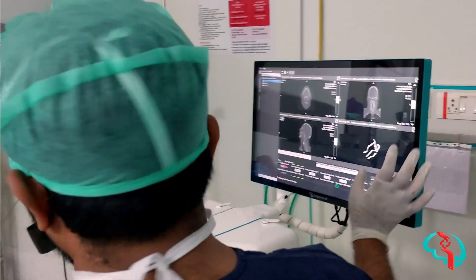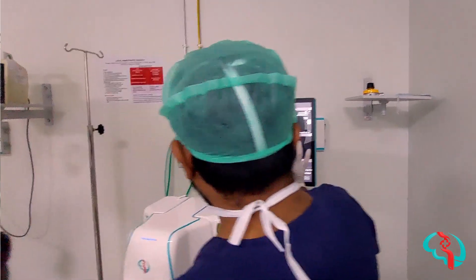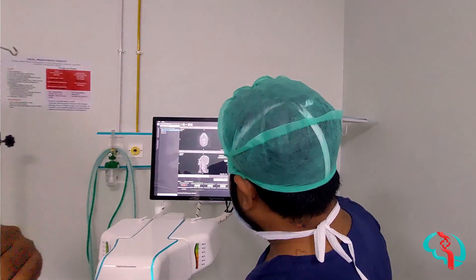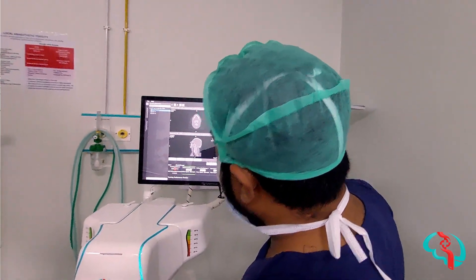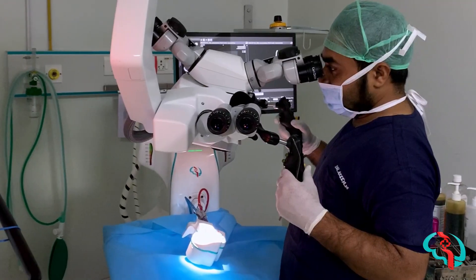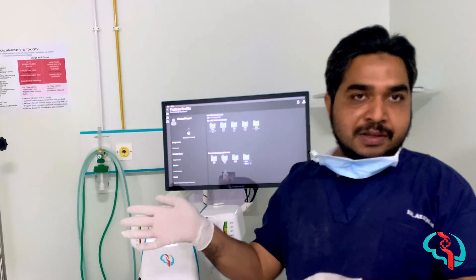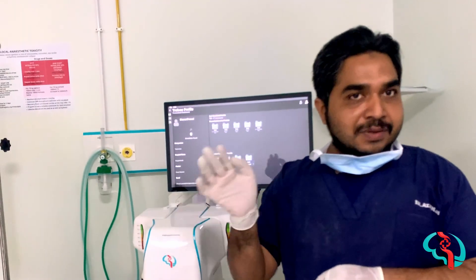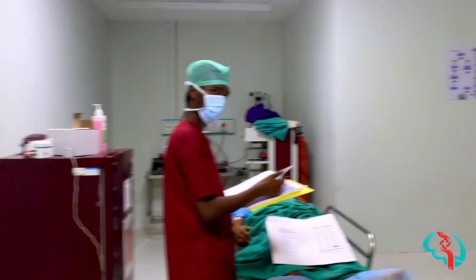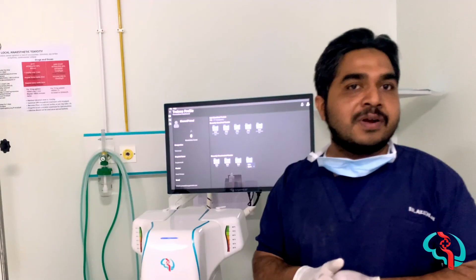You can feed the patient data pre-operatively, so that you can select the approach and the positioning itself. If your surgery is planned for tomorrow, you can feed that data the prior day and have just an orientation session for those 24 hours before.